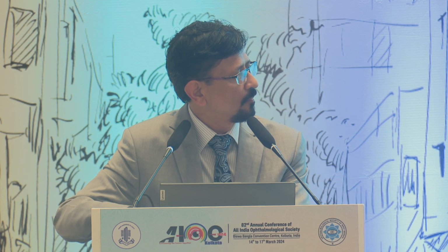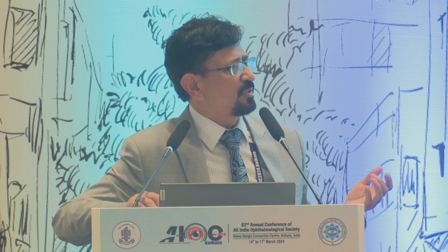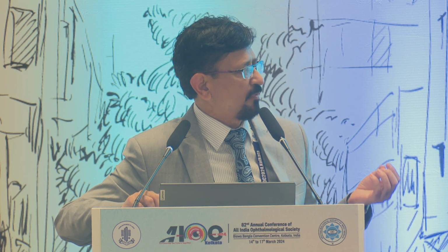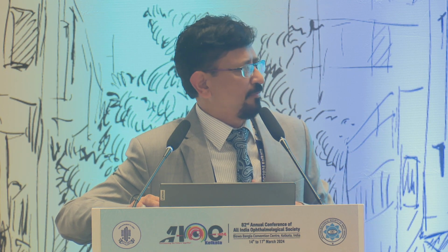Thank you, Dr. Rajesh. You talked about flap amputation. So is there any limitation to the thickness of the flap where you can amputate, or maybe some thin flaps can be done? See, most of the times these complications, like the flap buttonhole that was there, it was a thin flap only, and it can be amputated. But most of the times, these days, we hardly create a flap of 100 micron or 90 micron or 110 microns, even if you are using femto or you are using microkeratome.